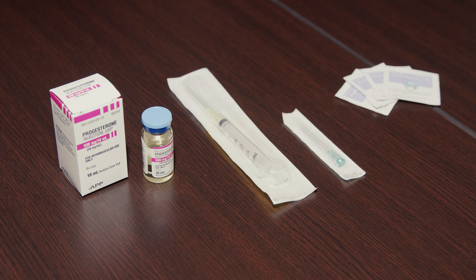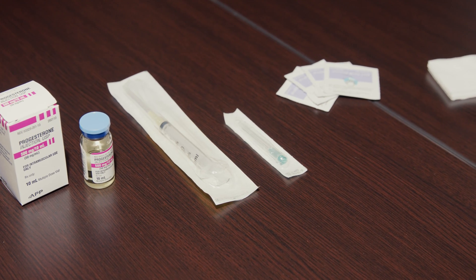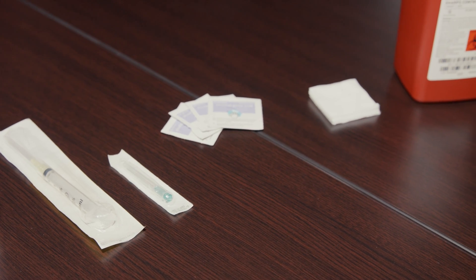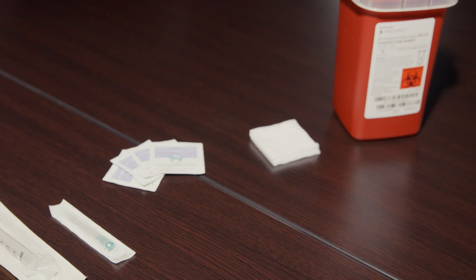You will need the following: a vial of progesterone and oil, syringe with attached needle, 23 gauge intramuscular needle, alcohol prep wipe, gauze, and a sharps container.